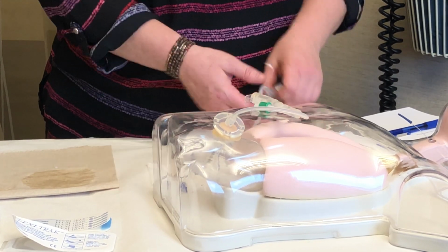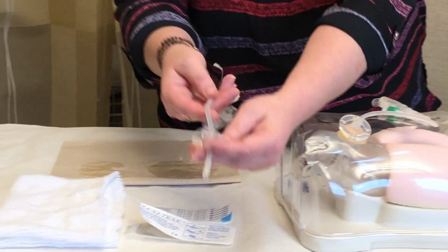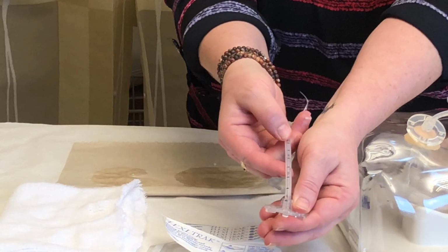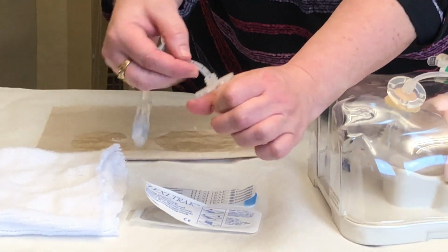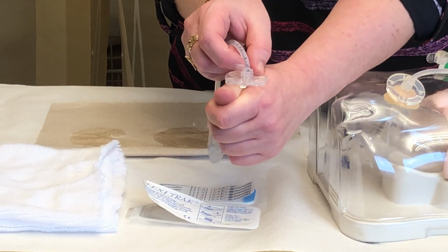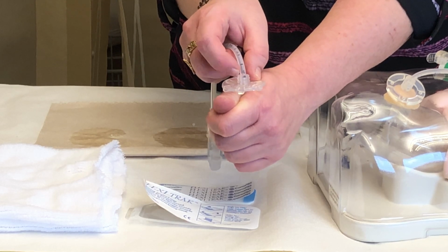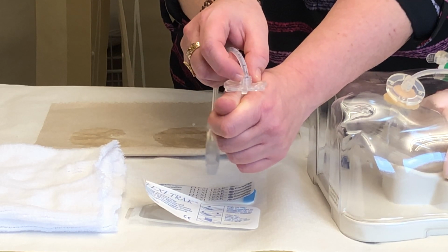The other thing we're going to do is look at what marking you can see on your skin disc, right above the skin disc. We always say check the number at the top of the skin disc. That number should be about the same day after day, unless you have to move it due to weight loss or weight gain.